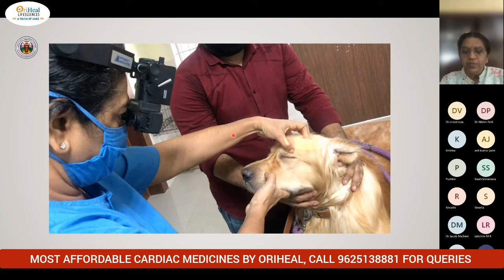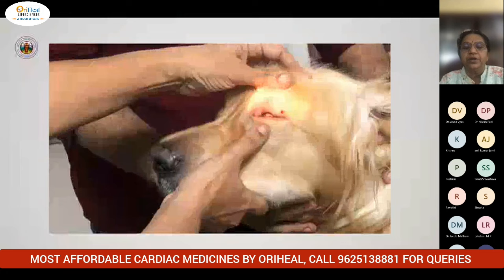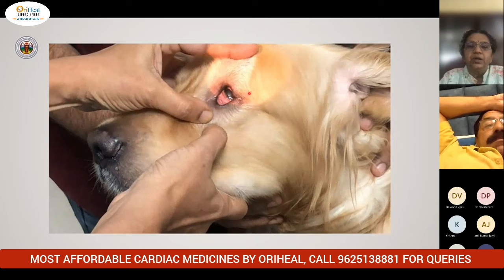So in this video, you can see I am trying to examine the palpebral rim, that is the orbital rim. We are just slowly reflecting the palpebral eyelids up and down, and then I am trying to apply some pressure on the medial canthus. So when you do this, the nictitans will prolapse more over the cornea.